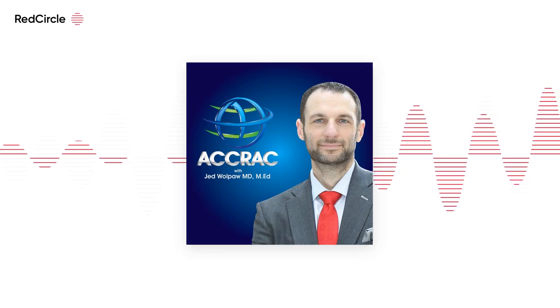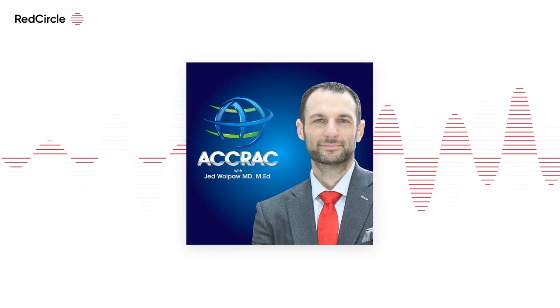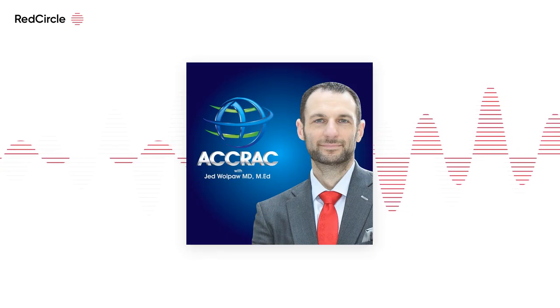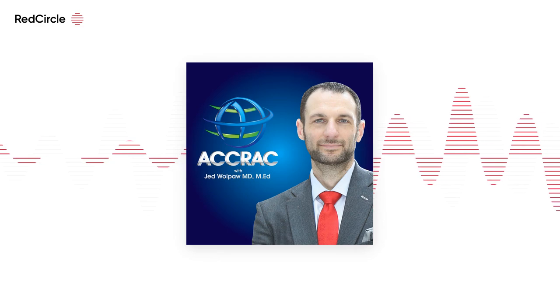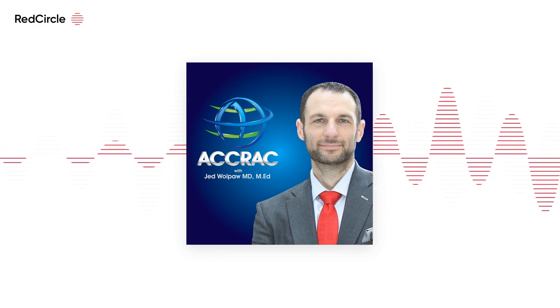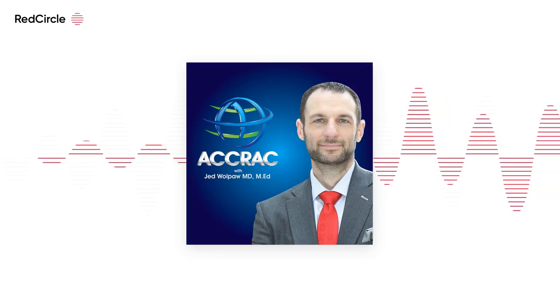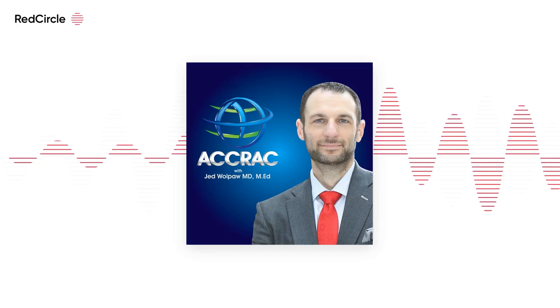It shows you compliance loss was 0 at the lowest PEEP, even though there could be overdistension. Each range just gives you a 0 reference point. So at the lowest PEEP, there's 0 overdistension, but at the highest PEEP, it tells you how much loss of compliance there was regionally at the higher PEEP level. So that's one line. The other line is at the highest PEEP level, they say there's 0 collapse. Again, not exactly true, but that's the reference point.